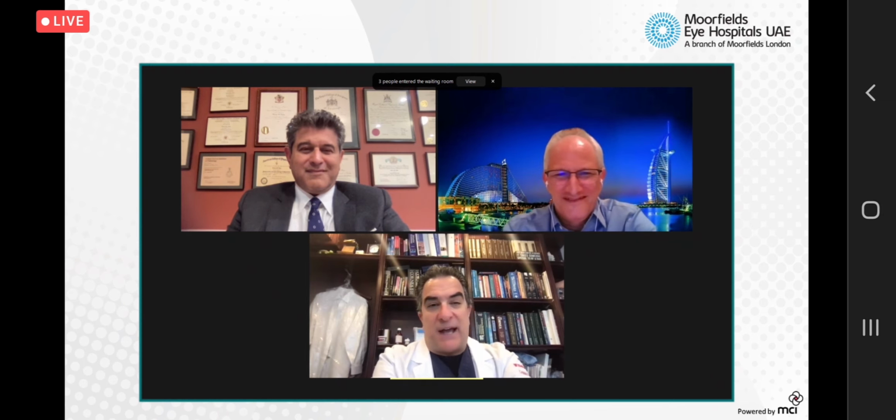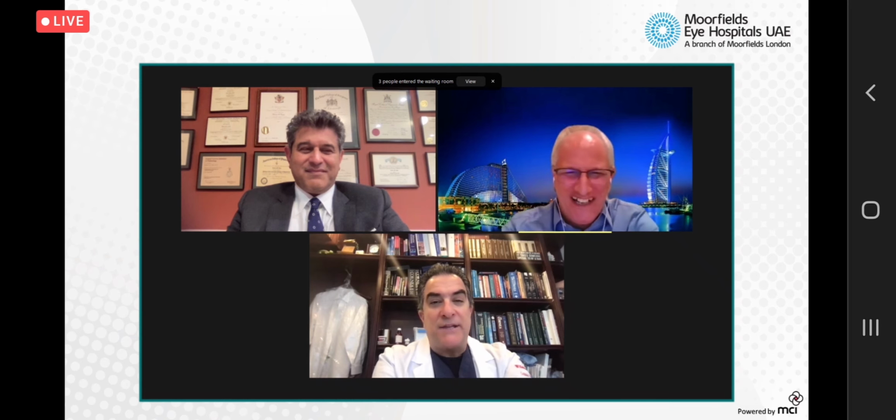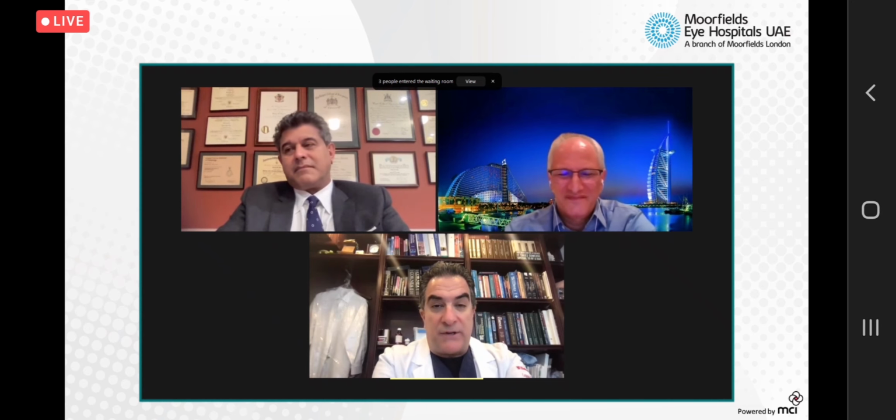Wow, Osama, that's a big topic, right? Okay, briefly. I'll cover it in 30 seconds. I'm a big fan of never leaving an anterior chamber implant in place. Now, that being said, many people will stand at the podium and say there's nothing wrong with an anterior chamber implant, especially if the patient has had a good vitrectomy, if the 4 feet of the haptics are sitting on the scleral spur, if there's no glaucoma. But that is rarely the case, at least in the patients referred to me.